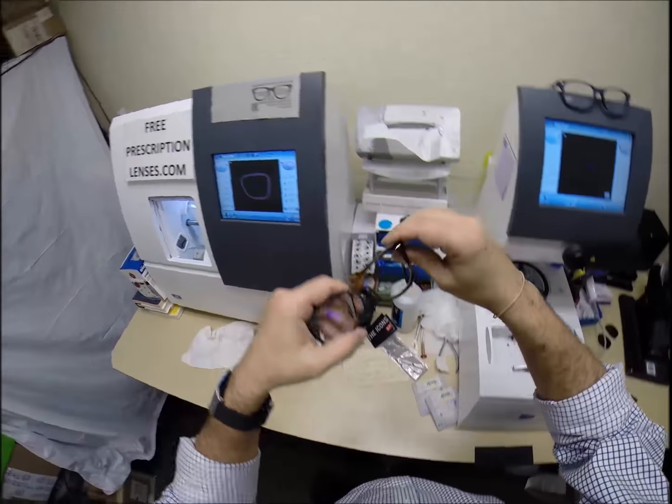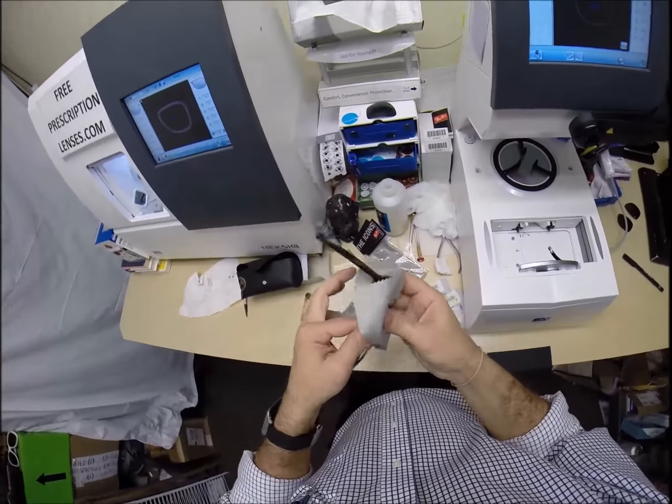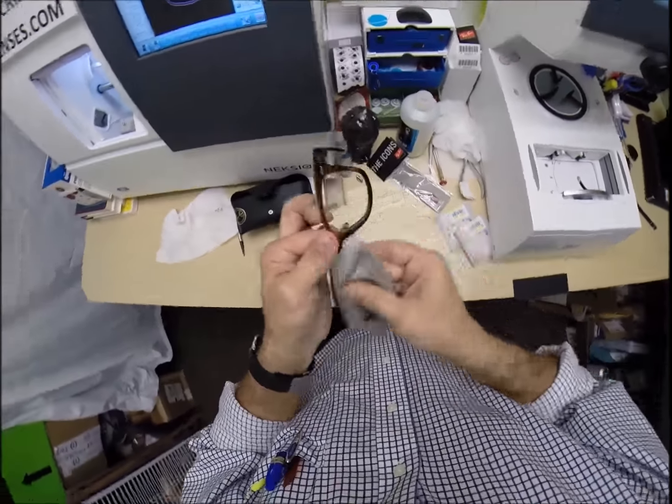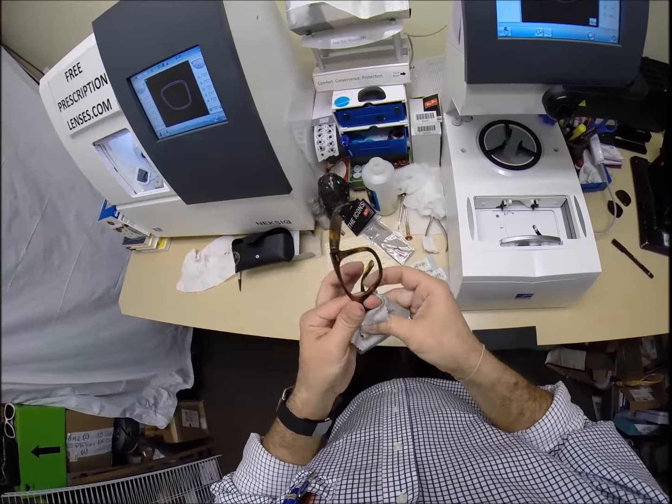So just stop by your local place and tell them if it's too loose or too tight or high on one side. Again, it only takes 30 seconds to a minute to adjust a pair of glasses. And I'm part of that 80%. When I take mine off, they wobble on the counter, but I'll show you in just a moment.